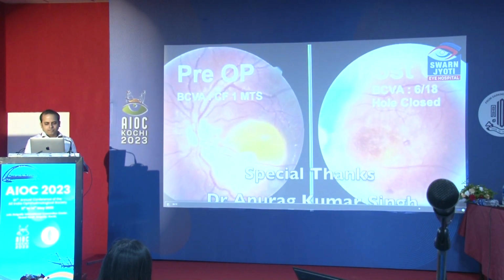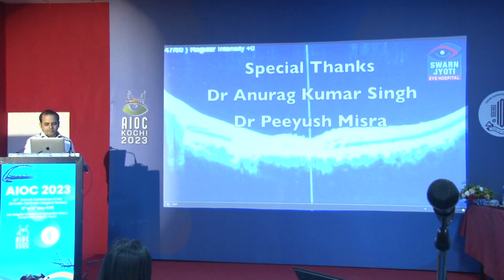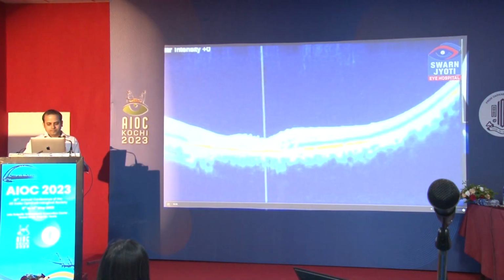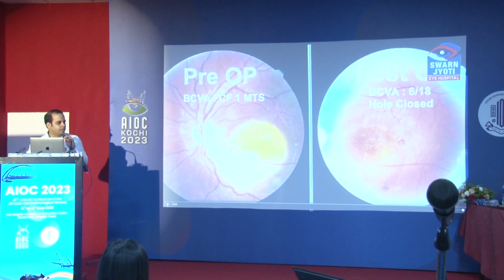So we got good outcomes after the surgery, a vision of 6/18, and the hole was closed. Thank you so much.